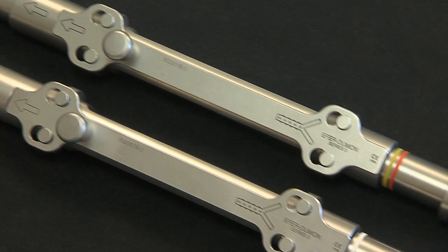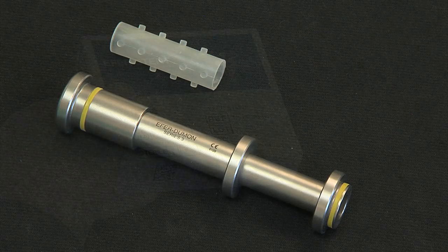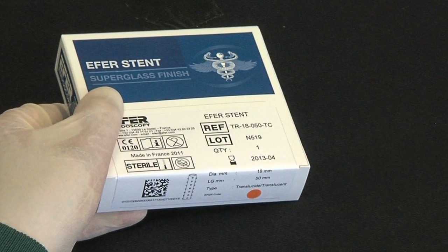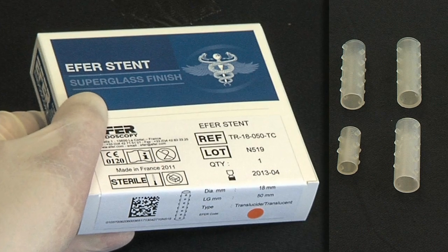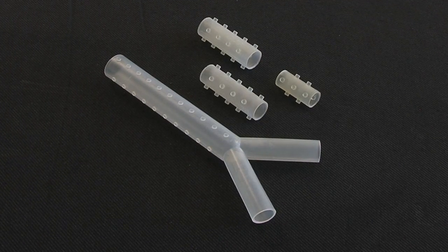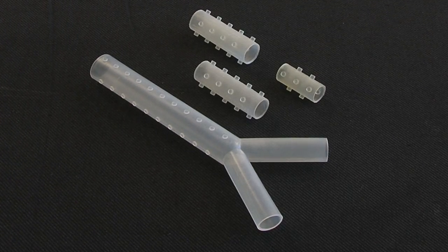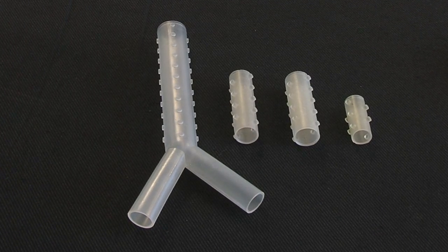For stent insertion in the introducer tube, two types of loaders are available for the different stents. EFER has developed a line of patented silicone stents known as EFER Superglass. Straight tracheal and bronchial stents of various diameters and lengths are available. Stent packaging has the same color code relating to diameter as the tracheal and bronchial tubes. For lesions located on the carina, various sized Y stents are available. Stents can be supplied in either transparent or radio-opaque silicone, covered with a biocompatible hydrophobic coating.